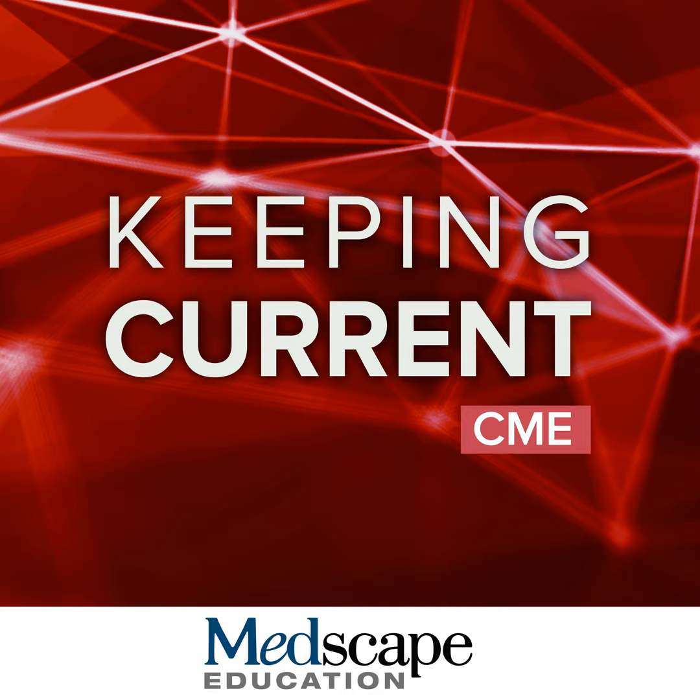Some have what we call red flags, meaning that they are accompanied, for instance, by neurological symptoms, focal neurological symptoms. So we try to get as much information as possible, either from the request for the MRI or from the medical records. At times we'll also call the referring provider to gather more information.